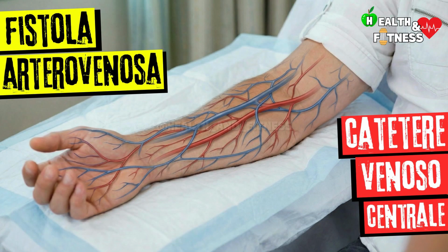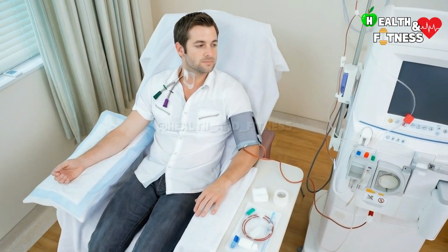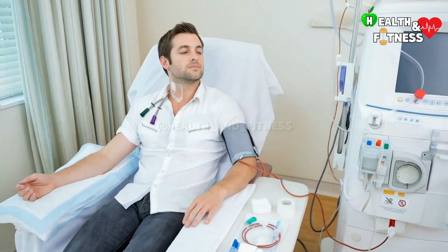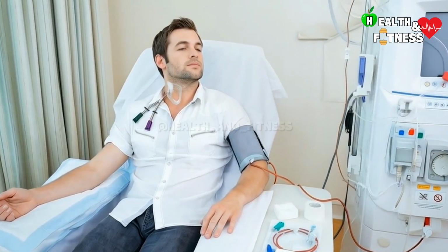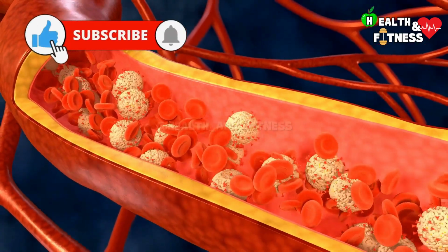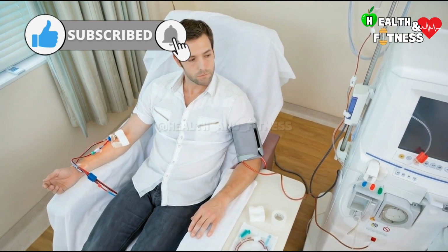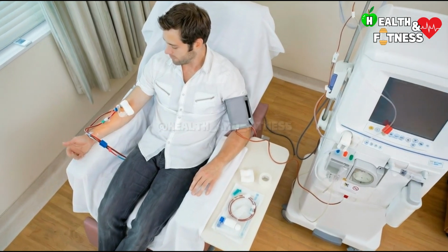In the case of a central venous catheter, a long, thin tube made of biocompatible synthetic material is inserted into one of the central veins, such as the internal jugular or the femoral vein. Compared to the arteriovenous fistula, it can be used immediately but carries a higher risk of infections and thrombosis. Once the vascular access is prepared, the patient is connected to the hemodialysis machine.